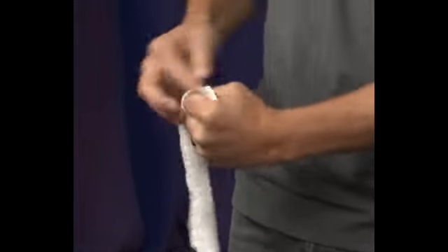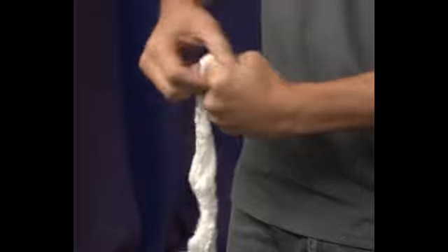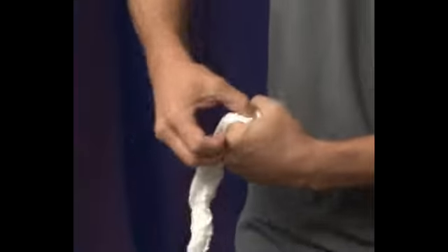We're pushing this in — I can pack with the thumb, I can pack with the finger — and my fist is still clenched. I'm still holding this very, very tightly as I push in, trying to fill all the nooks and crannies between my fingers, inside the knuckles, pushing in.